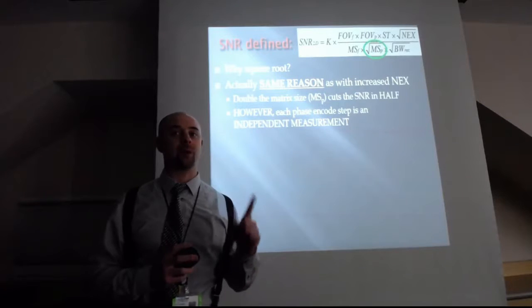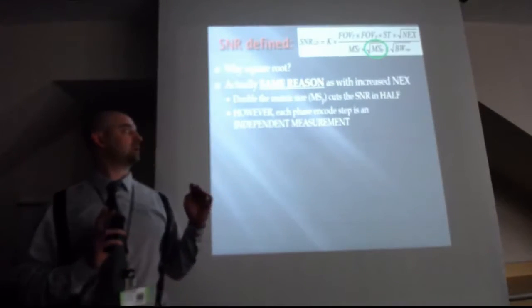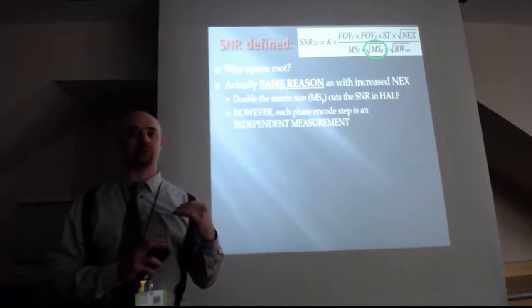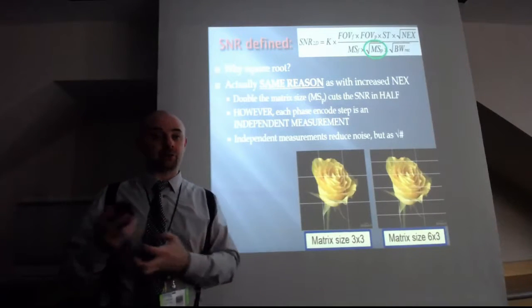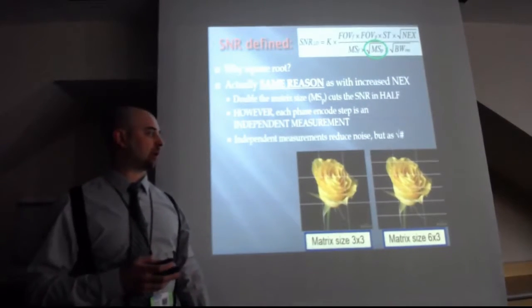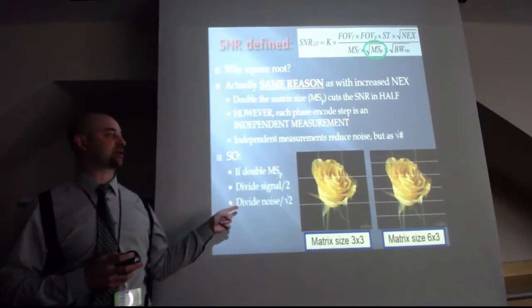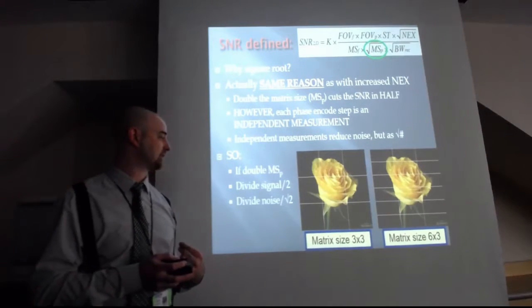steps you do. Remember, at least for the basic spin echo MR, the number of phase encoding steps is going to be the number of experiments you do. And remember that increasing the number of experiments will increase the signal to noise ratio, as a square root. So we are reducing the number of protons we're imaging in each voxel, but we're also reducing the noise, right, by radical 2 because we're introducing extra measurements.